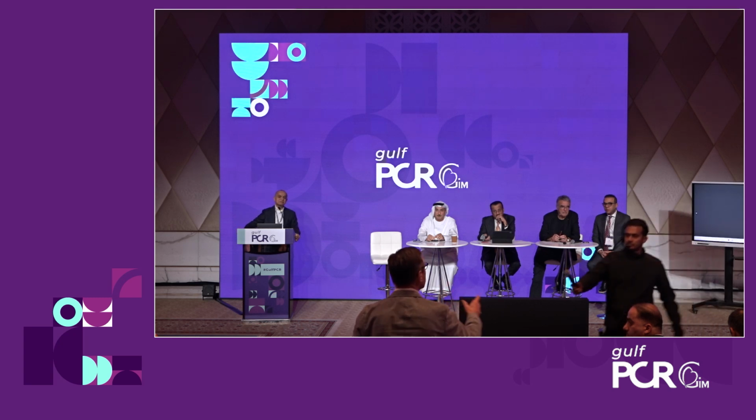Anybody? Any answer for Dr. Ahmad Haddad? Yeah, I can probably comment on that. So yes, this is the next step of the development, to develop more balloons with a compliant material to overcome the need to exchange the balloons during the procedure. But even so, I have to say right now, in our procedure, on average, we need about 1.7, 1.8 balloons, not more. But the future is truly, one is transradial, and two, together with a one-size-fits-all balloon.